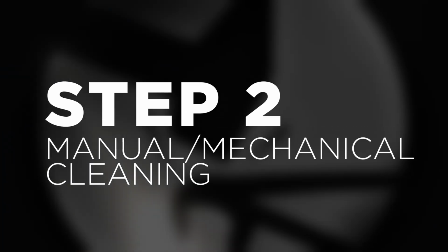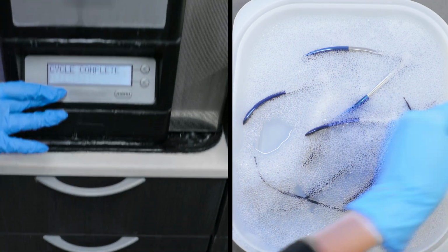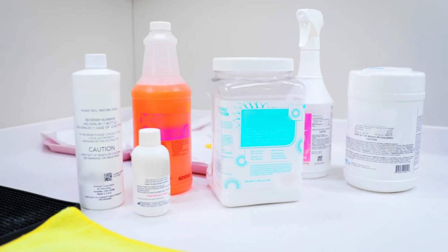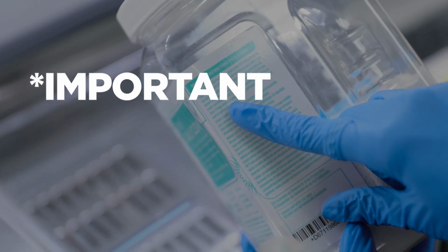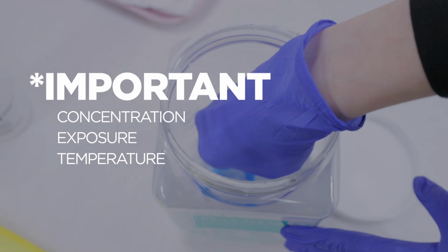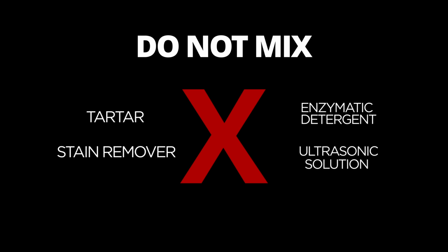Step 2. Manual or mechanical cleaning. You can clean or disinfect your instruments using a manual or mechanical method. For manual reprocessing, the instrument should be placed in an OSHA-approved enzymatic detergent or disinfectant. It is extremely important to have the correct concentration, exposure, and temperature specified by the manufacturer of the detergent or solution. Do not mix tartar and stain remover with enzymatic detergent or ultrasonic solution.